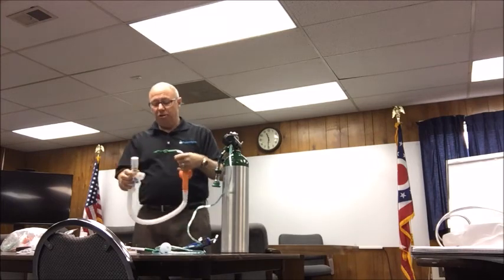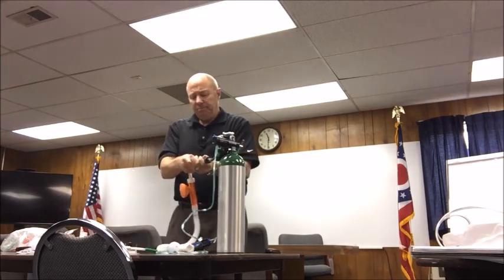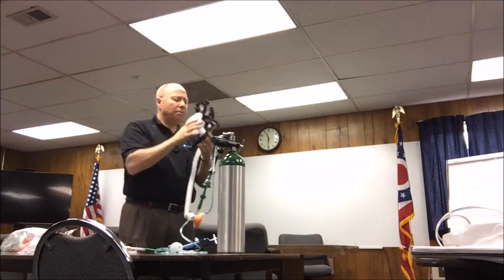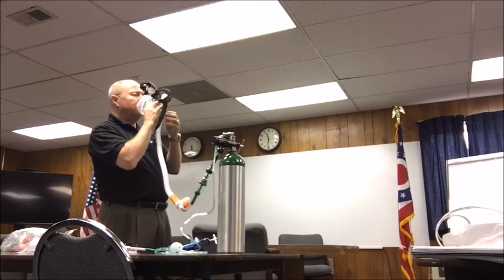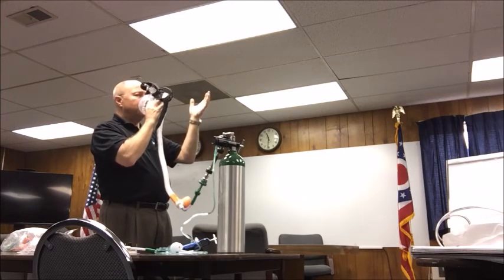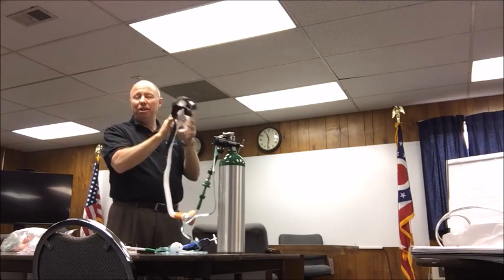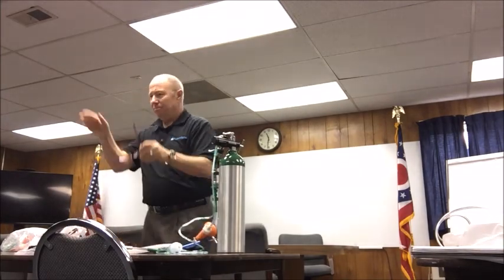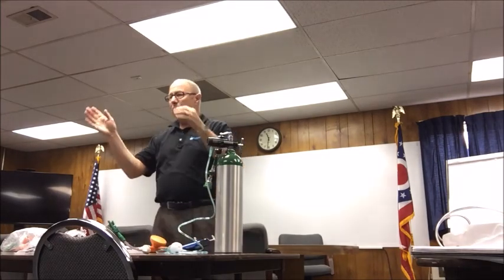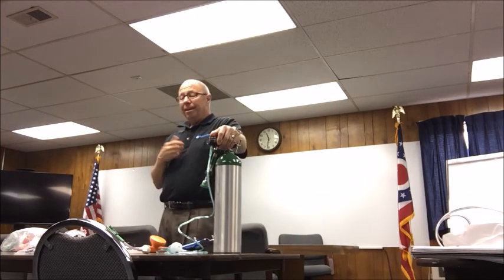I'm going to put this mask on. I'm going to show you what I mean when I say it kind of pressurizes against my face. See how it's flowing against my face? Well, I don't have anything on this. It's blowing against my face. So I stress that a lot, because I've dealt with a lot of people that have gone from the emergent to this, and I usually get called, oh, it's leaking, the mask is leaking, and the answer is to loosen it, which is really a good thing. Any questions?